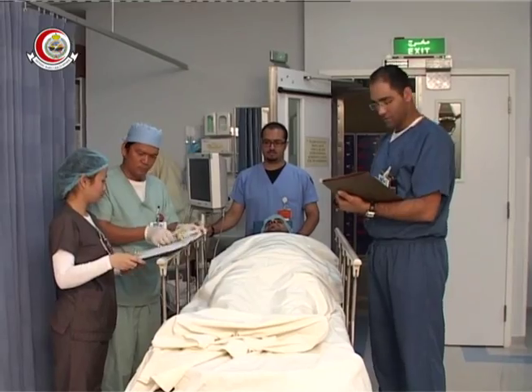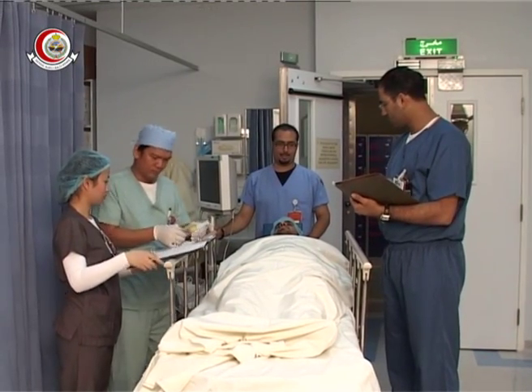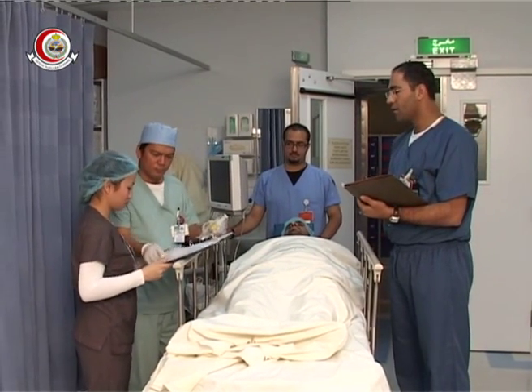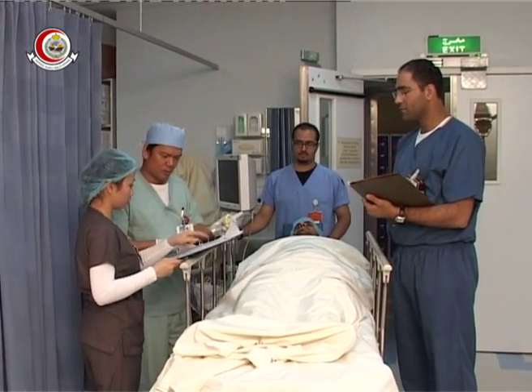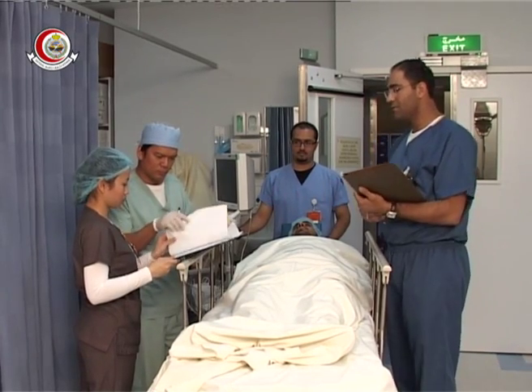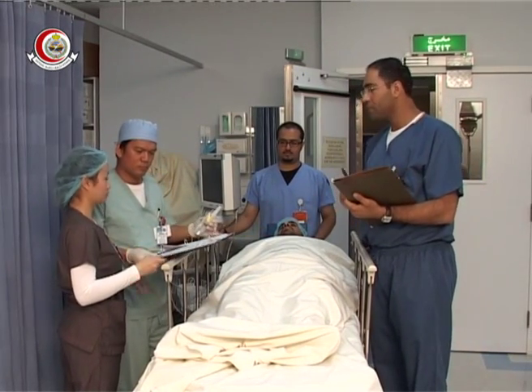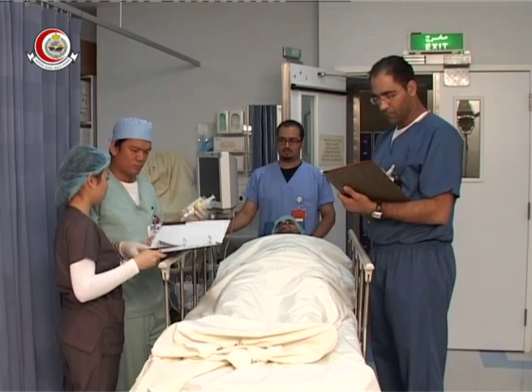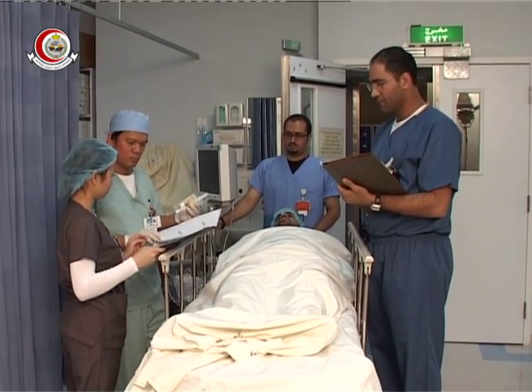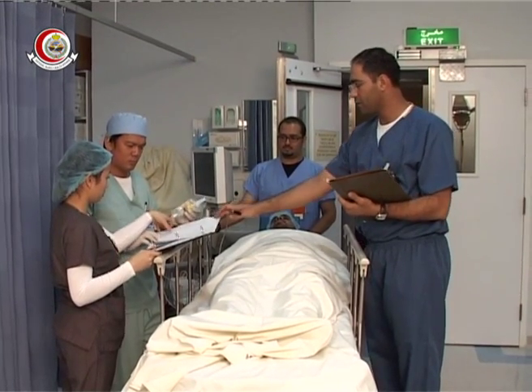The patient arrives at the angiosuite accompanied by the primary nurse from the ER and the anesthesia team. The patient is received by the angionurse. The primary nurse endorses the patient to the angionurse with the pre-ordered TPA.